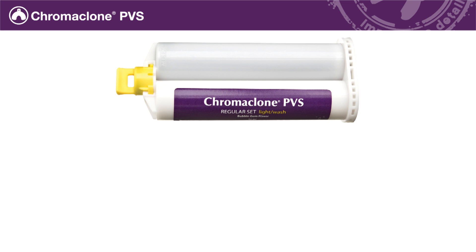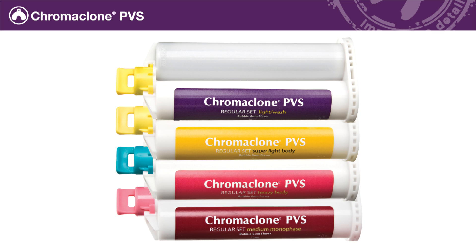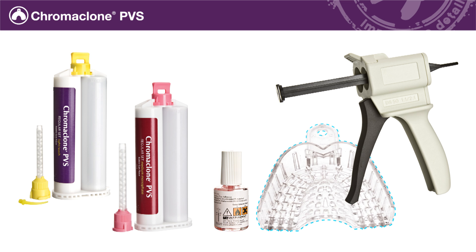To make the impression, you will need Chromaclone PVS light or super light body, and heavy or medium body, a dispensing gun, tray adhesive, and a standard disposable impression tray of your choice.